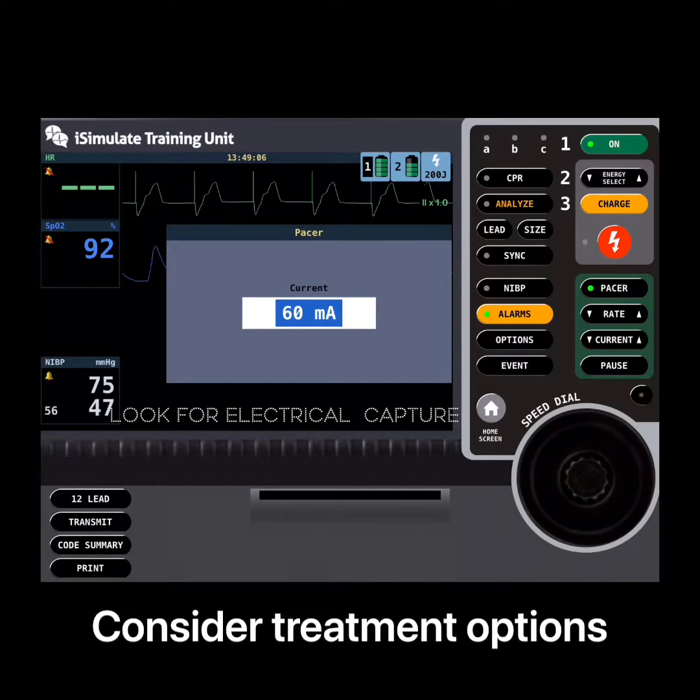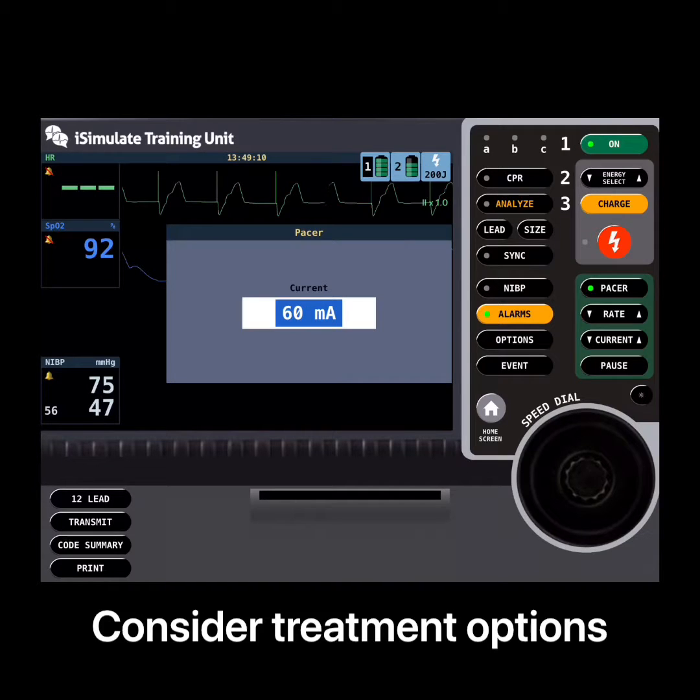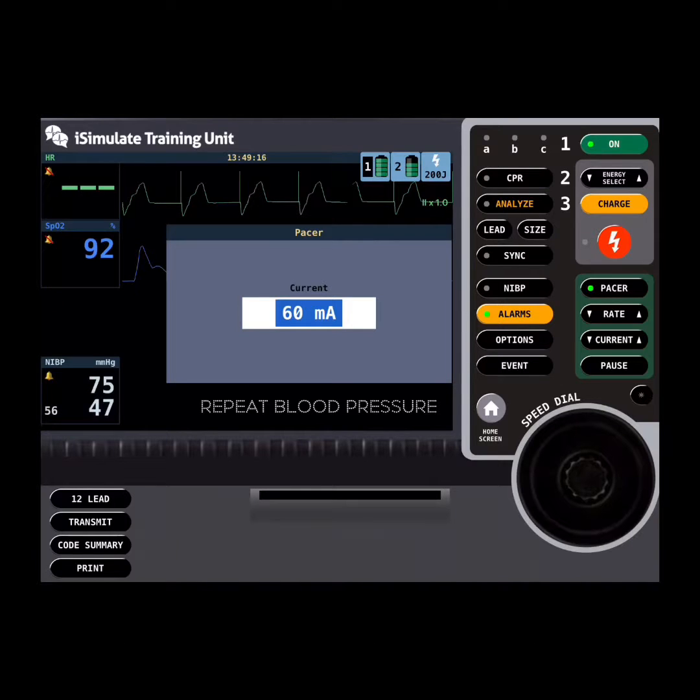Life was starting to get better and the patient was starting to improve. The next logical thing for them was to, again, go back and repeat that blood pressure, and you'll see them doing that on the screen. They're starting now to talk to the patient, who's beginning to wake up again.